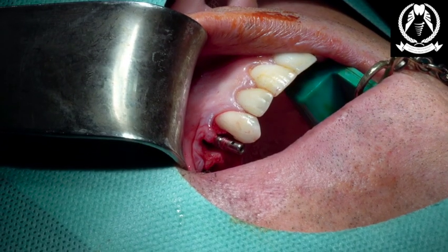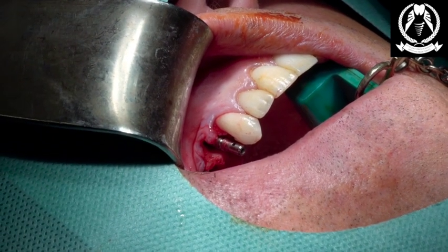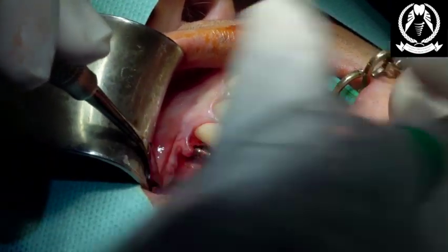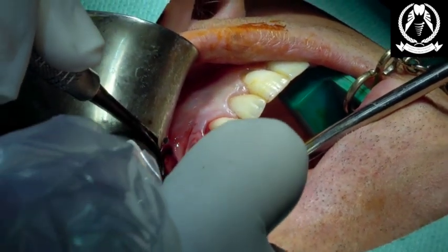4.5 by 10. Okay, so you've gone onto that space. Measure that bone. More like here. So what we've got is 5 mil, 7 mil stop with the gingival stop here. I want to parallel up to this particular implant here. I want to change mode.